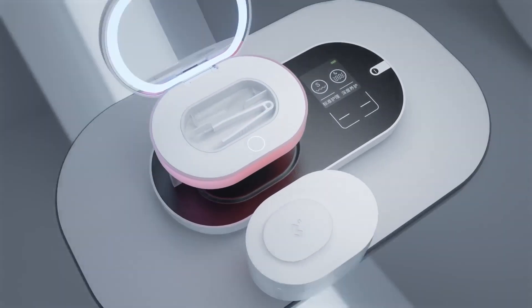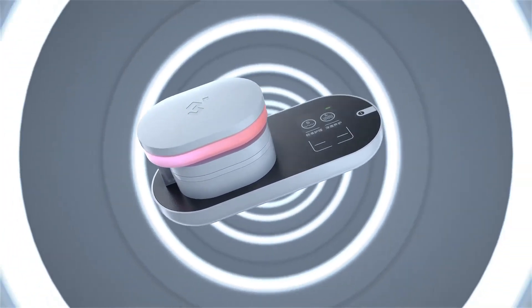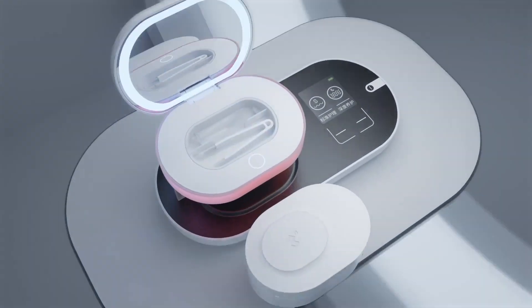Introducing ReO2, the world's first contact lens renewer designated for protein removal — an FDA-approved product.